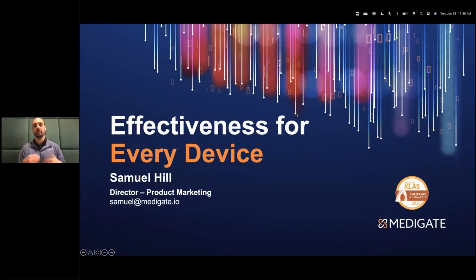When they're powered off, that is a challenge, because obviously devices that are not transmitting on the network are the same as the analog devices that run around and are not connected to the network because they're just powered off. So we use things like RTLS and RFID tags or BLE beacons to report into our system the physical location of that device. So even when it's powered off, we still have ways to accurately track the physical location of the device itself.